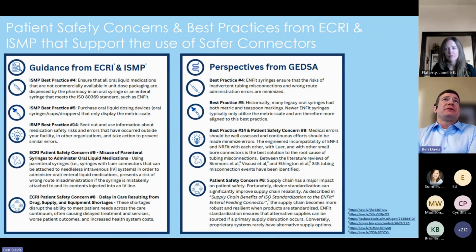The one thing I wanted to share real quick too is we're talking through some of these advancements and improvements. Over time, along with these, we've seen many best practices that have come out of ISMP. You're probably all familiar with those and see those when the lists come out every other year. They put out a new list, but then also ECRI, they put out their top 10 patient safety concerns each year, and I just wanted to share this flyer that we put together because a lot of these things, they don't necessarily come right out and say it, but if you actually kind of read between the lines, by actually moving to ENFit, NRFit, and or both, you can actually satisfy some of these best practices or adhere to some of these patient safety concerns.